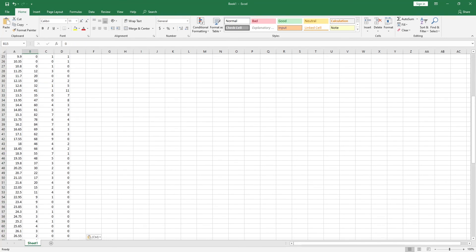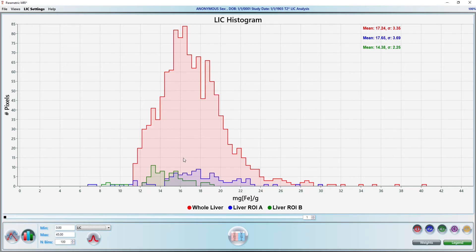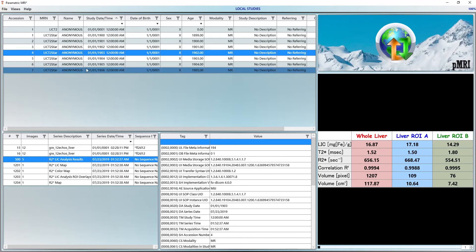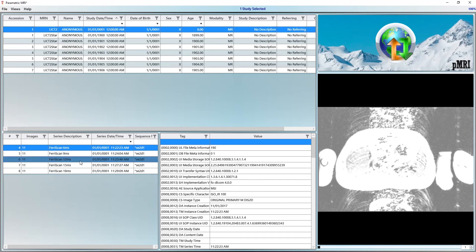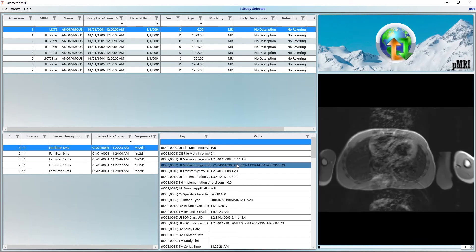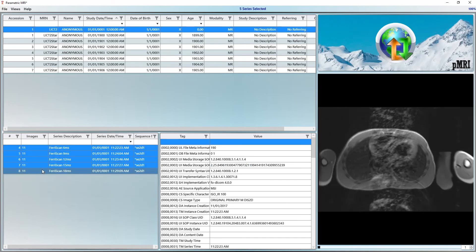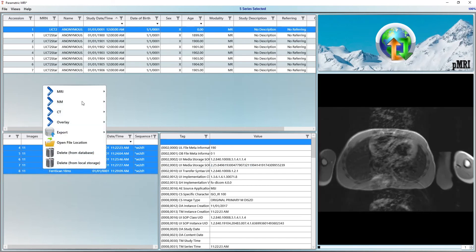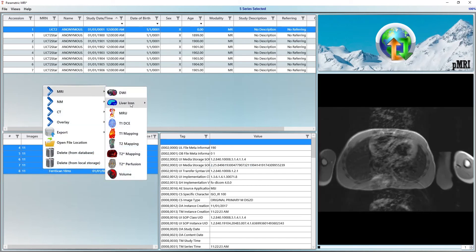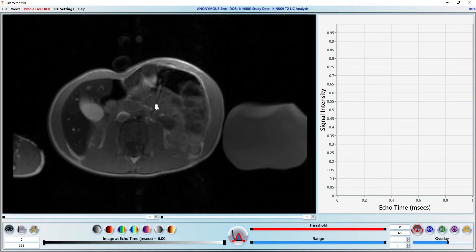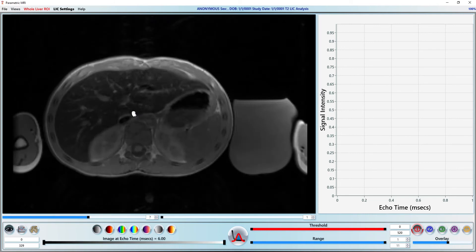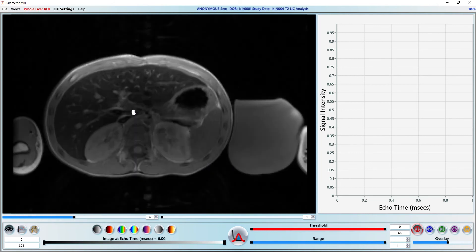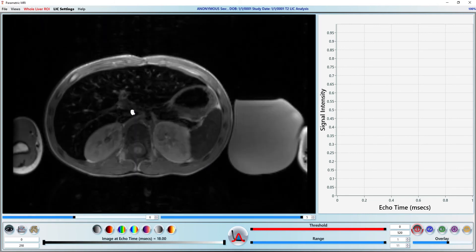That finishes the R2 star portion of the video. Let's take a quick look at a Multi-Echo SpinEcho R2 dataset. Let's select the appropriate case and series, right click and select T2 LIC from the menu. Since this is a multi-slice dataset, scrolling with the mouse wheel will change the slice and holding CTRL while scrolling will change the echo time.